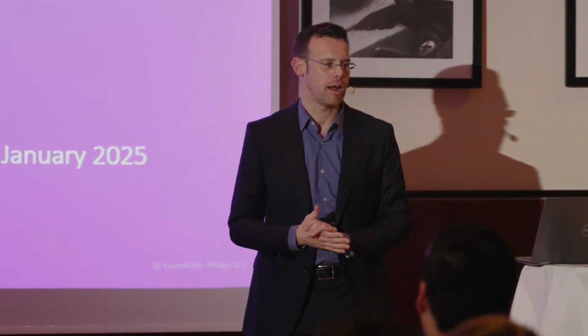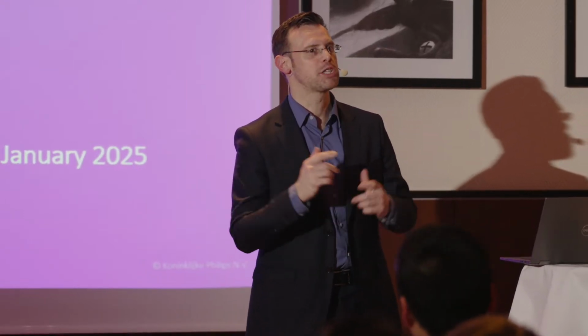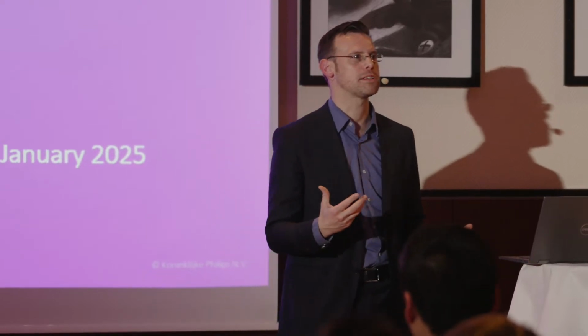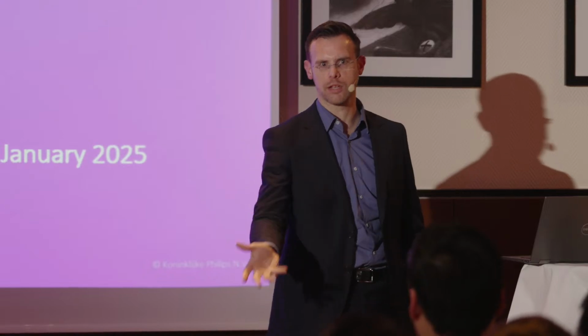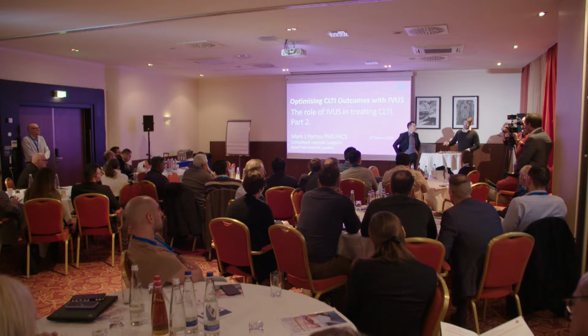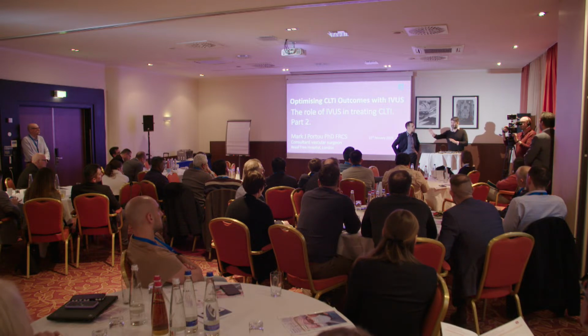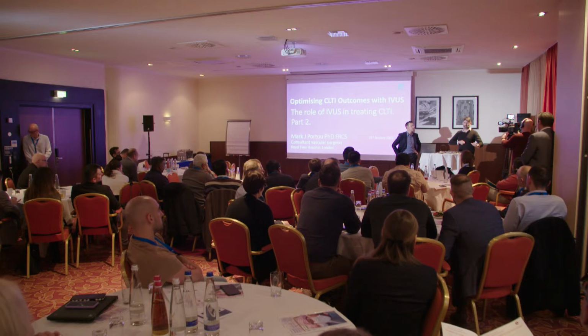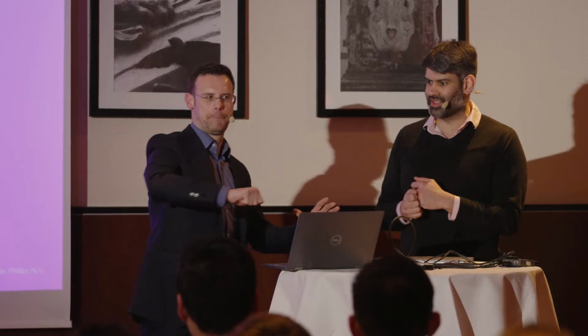And as I say, with our relatively new machine, which we've had about 6 months, that has really sped the process up because it enables us as the operator to take control of it. Do you find the same? Yeah, basically we're all control freaks. But to that point about going distally, one tip I always give to our nurses when we're setting up is don't connect it yet. Get the IVUS into the body, take it as distal as you think you're probably going to need to, and then connect it. Then it will get that far, and everything else coming back is easy. So when you're setting up and using it for the first time, pull everything towards yourself.